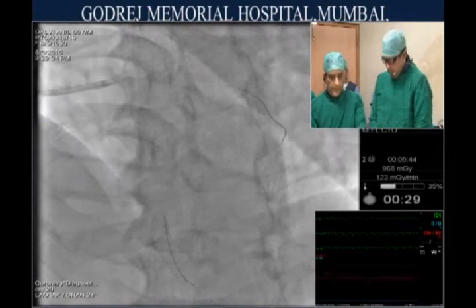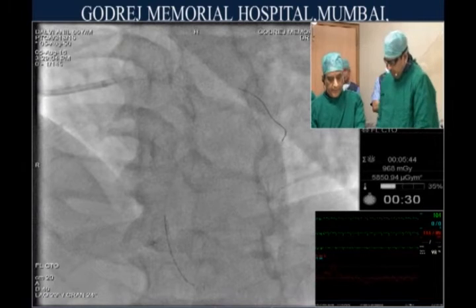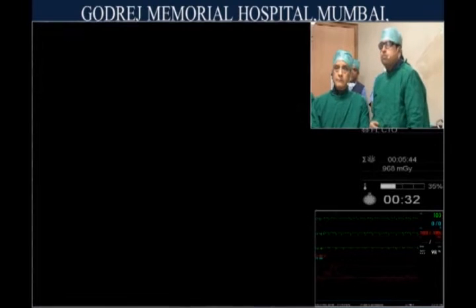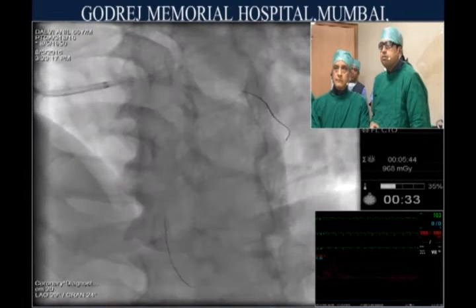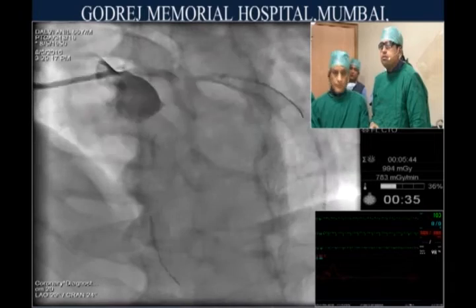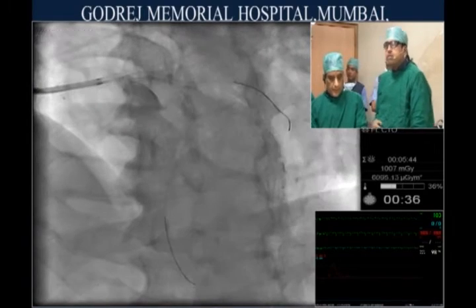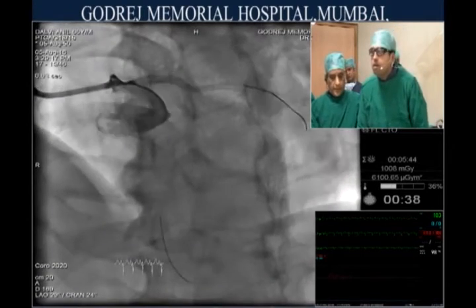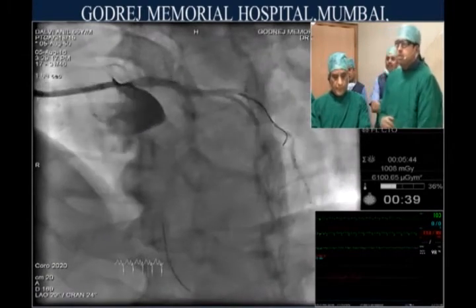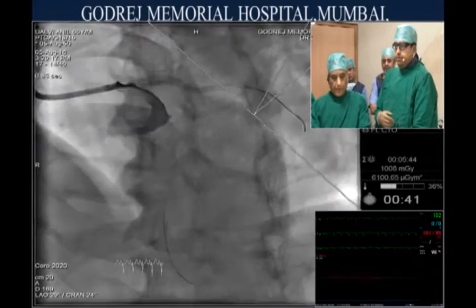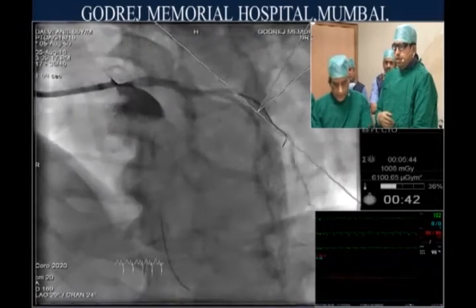Let's take a picture — I think we've covered the ostium. Very good. Let's go to the caudal view.